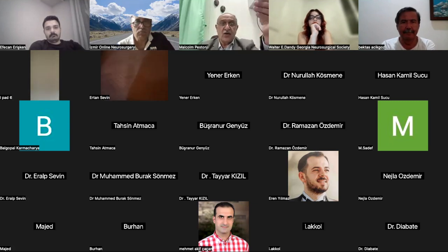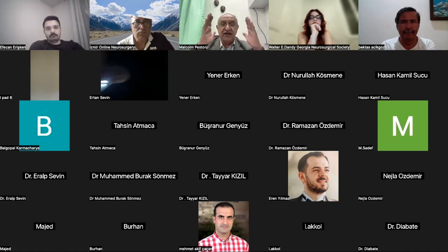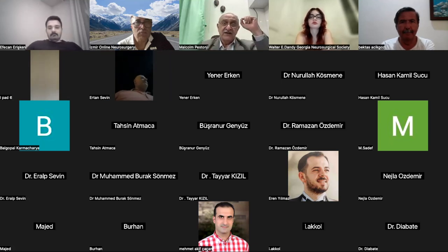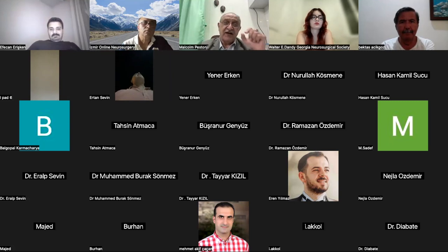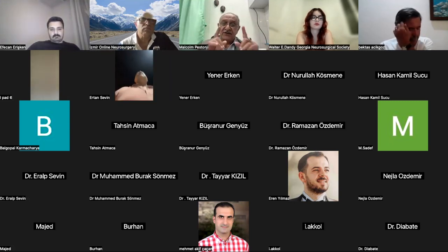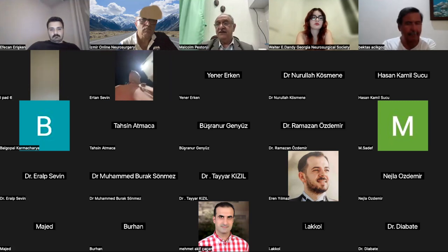Bypassing the entire normal disc, I'm just taking a 4 millimeter track in a disc which is 17 millimeters across. So I am preserving the rest of the discal material, which even in a microscopic setting, you are going to remove definitely more of the anterior discal material. So that is the core difference. Next question, madam.